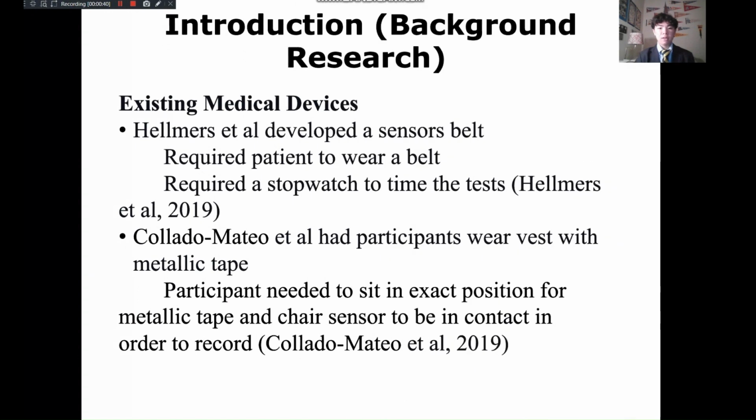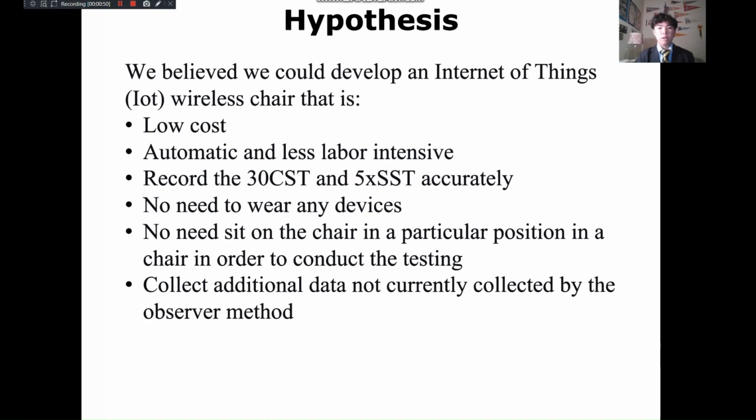There have been existing medical devices created for these tests, but they either required external devices or were too cumbersome for patients to perform. And so for our hypothesis, we believe we could create an IoT chair that was both low cost and could record both of these tests automatically and less labor intensively, without any of the previous studies' limitations, while also collecting additional data.